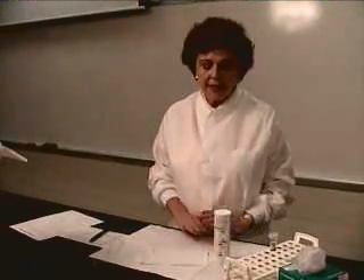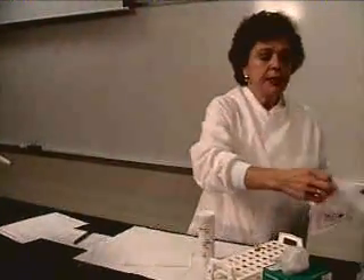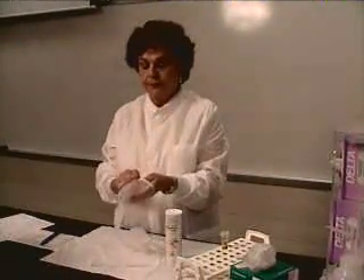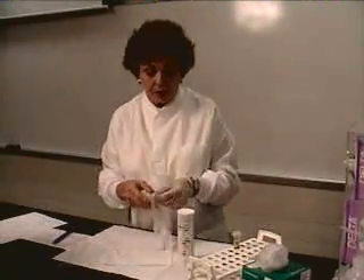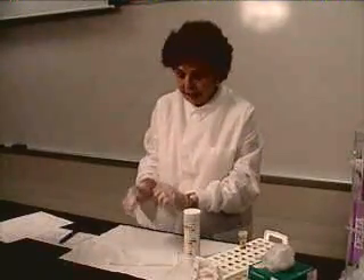Hello students. Now we are going to discuss the chem strip dipstick, or what we call urine dips. First thing we need to do is to put on our gloves. Anytime we are dealing with body fluids, we do wear gloves and our lab coat.